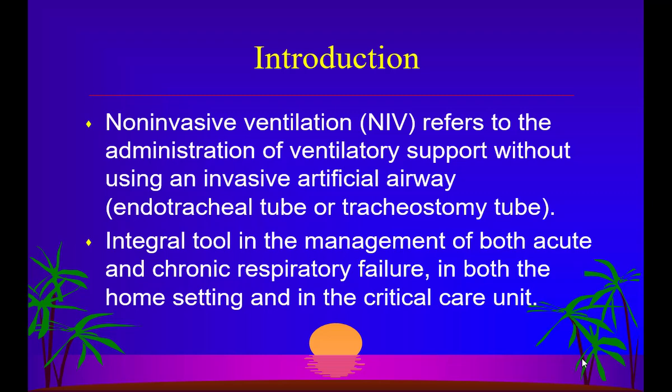So non-invasive ventilation basically provides a window of opportunity where it may avoid the use of invasive mechanical ventilation in a substantial number of cases if appropriately selected. So that's the beauty of it, and that's why this topic is very close to my heart. Non-invasive ventilation in India started somewhere in 1996, and then it has really taken off, and now practically every ICU has this facility.